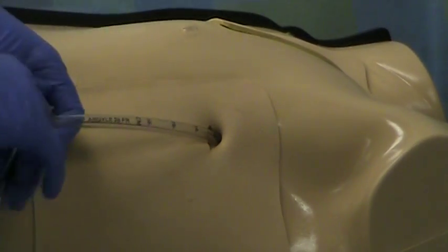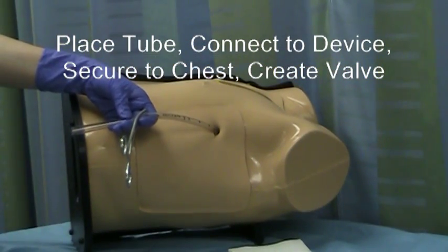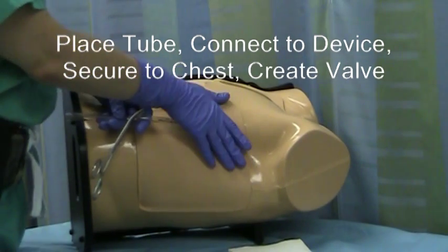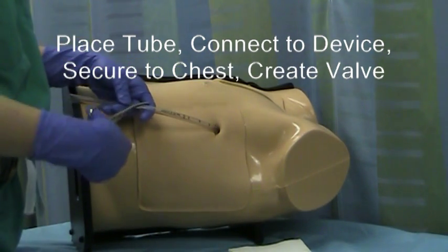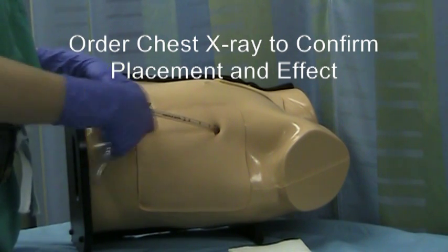Once you've done this, you would certainly then connect your chest tube to your Pleurovac or your chest tube apparatus and secure your chest tube with a suture and a gauze dressing, as well as ordering a chest x-ray to ensure proper placement and adjust it from there.